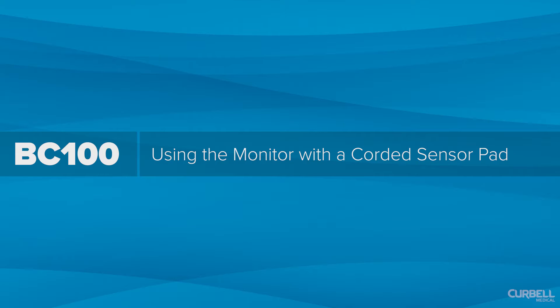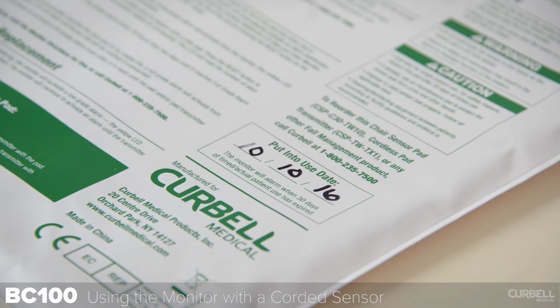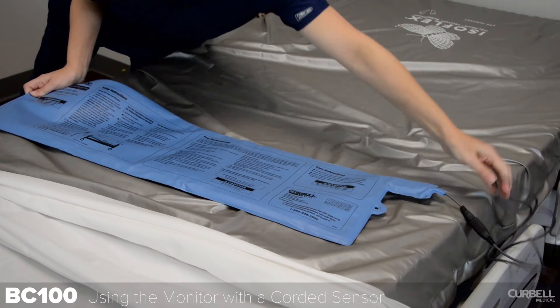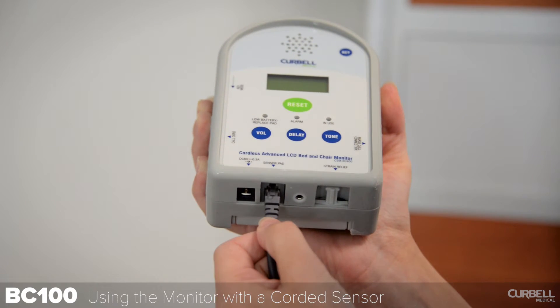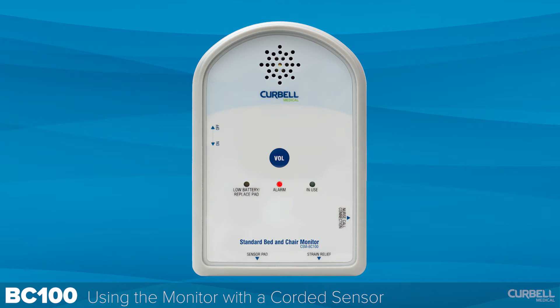Using the monitor with a corded sensor pad. If using the pad for the first time, write the put-into-use date on the pad and, if applicable, the expiration date. Lay the sensor pad completely flat, positioned where the buttocks of the patient will be placed, with the pad stem coming out of the back of the chair or side of the bed. Plug the sensor cord into the monitor sensor jack and run the sensor cord around the strain relief to help prevent tension damage to the cord and input jack. The monitor will alarm if the cord is disconnected, and may be canceled by turning the on/off switch off then on again, or reinserting the cord into the monitor.